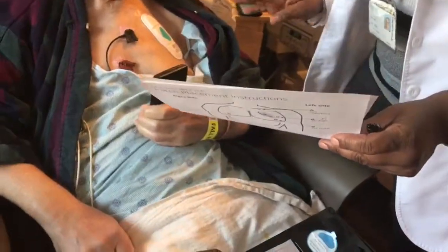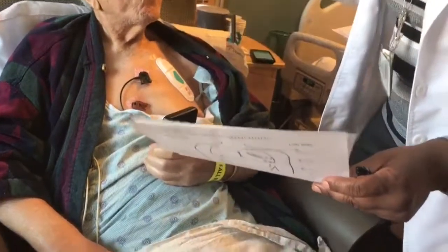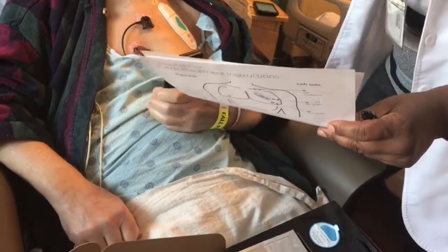If you have any shortness of breath, chest pain, or dizziness, record your event but also call the doctor's office.